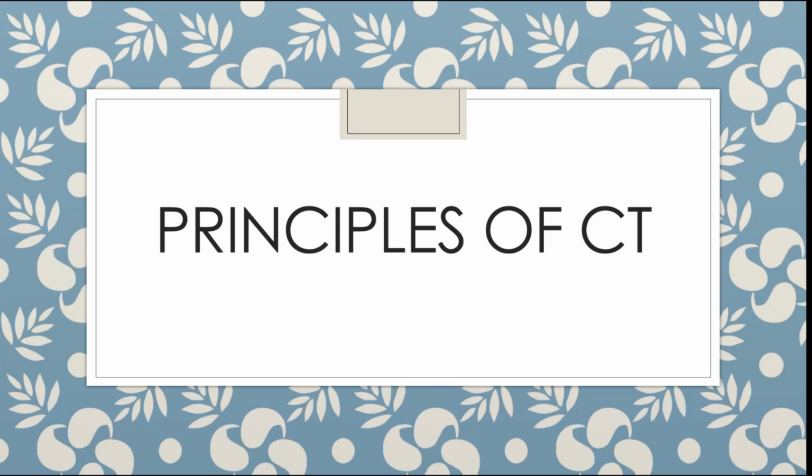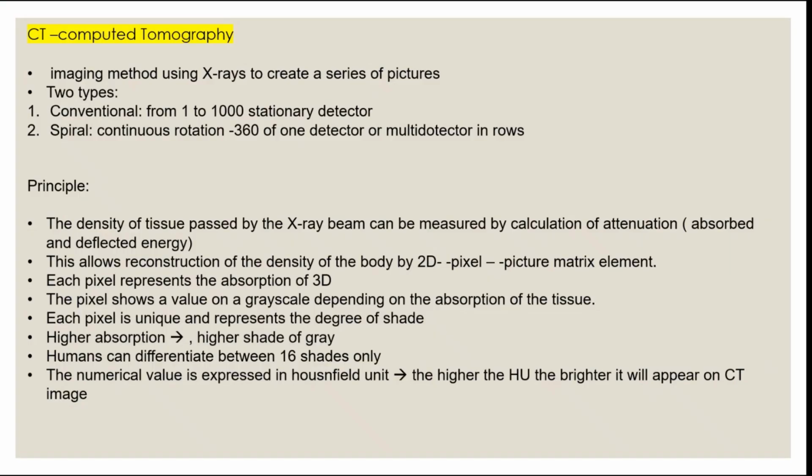Principles of CT. Do you have any question for X-ray before I move on to CT, or is everything all right? Okay, so I'll move on with CT. CT is mainly based on the X-ray method, but the difference between X-ray and CT is that we have two types. We have conventional and spiral.